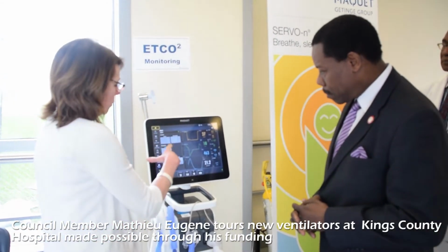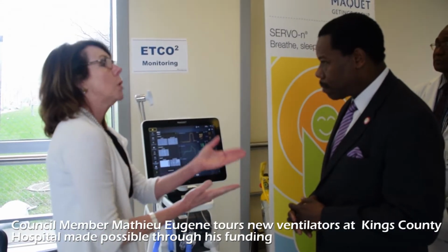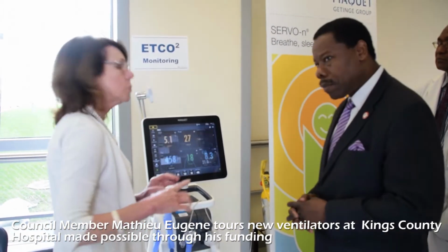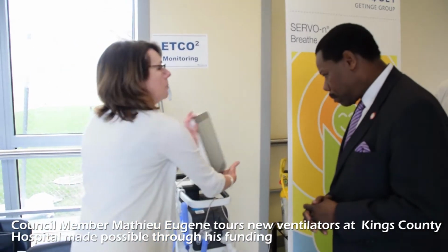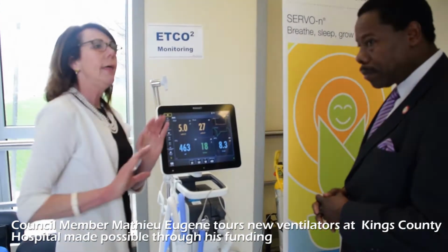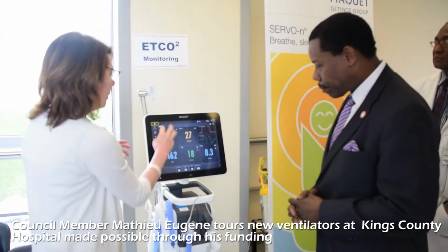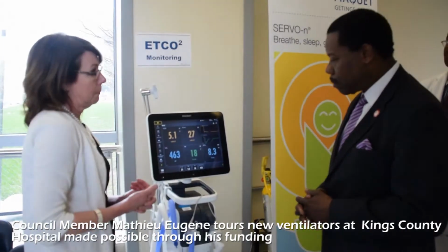I have this loops view on right now because a lot of the doctors look at pre-medication and post-medication, and they can keep track of all that. In addition, the nurses really like this one because when they leave the room, it's really hard to see the numbers from outside. So they can actually move the screen. It has full movability. It can go up and down for their height, and they can put this towards the window so they can see what's going on with the patient at all times. If an alarm goes off, the block where the alarm comes from, if it's a high pressure or if the respiratory rate's high, that will light up.